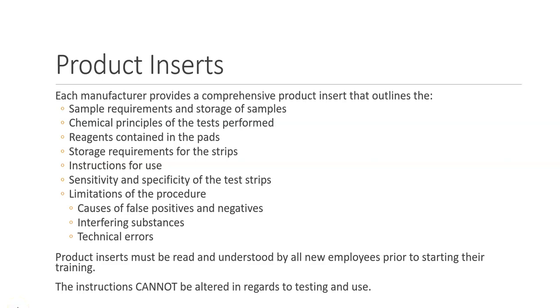Product inserts must be read and understood by all new employees prior to starting their training. It's imperative that you read the procedure thoroughly, and most places will convert the product insert into a written procedure. So the first thing you do is you read the procedure, and then somebody will demonstrate the procedure to you, and then they will have you perform the procedure under direct supervision.